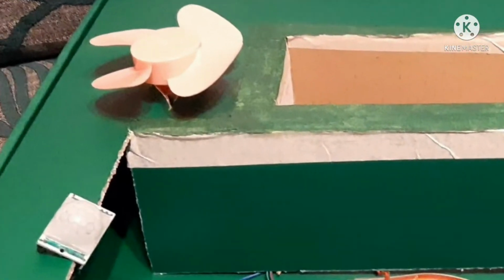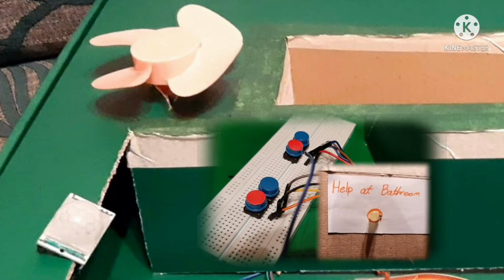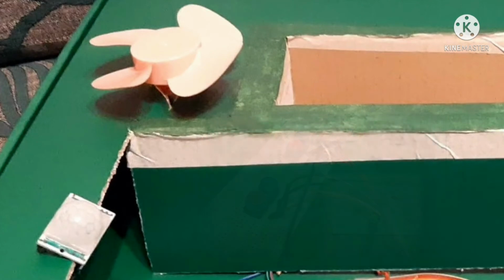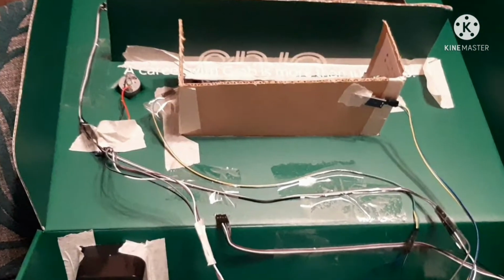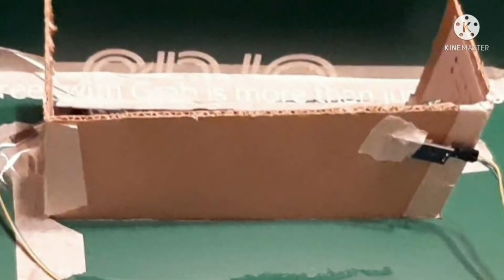The edge of this box represents the lavatory, where there is a motion sensor and a ventilation fan. There are also two pairs of buttons which triggers the yellow LED at the MU room. Now let's open and look at the interior wiring. From this view, you can see the buzzer at the MU room which will be triggered for serious emergencies.